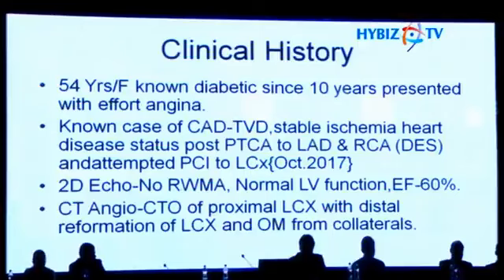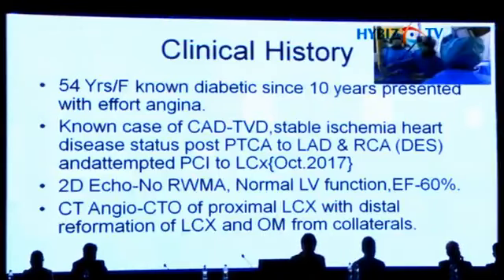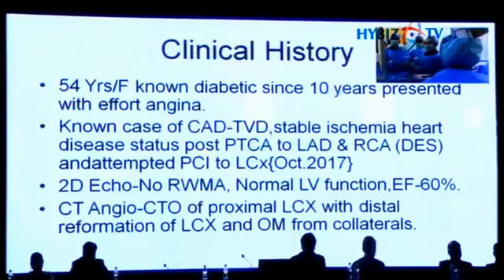Let me apologize for changing the case. Actually, an LAD CTO was planned, but the patient had a fever, because of that we changed the case. This is a 54-year-old female patient, diabetic, who underwent PCI one year ago to the LAD and RCA. Recently she presented with a CTO. Initially one of my colleagues attempted a PCI for the CTO of the LCX but couldn't perform it due to dissection, so they postponed. Today we are keeping this case for live transmission. He will explain all the rationale. Next slide.